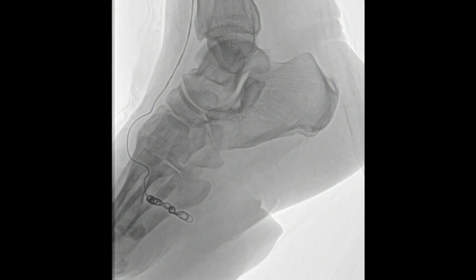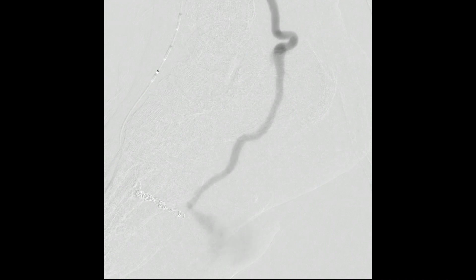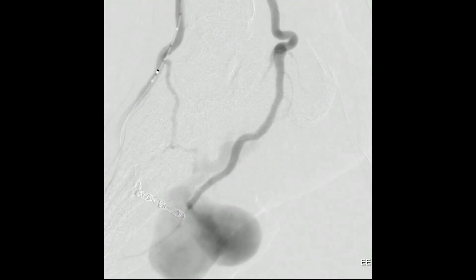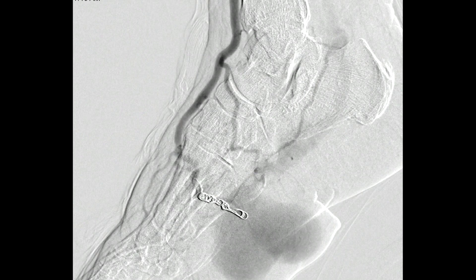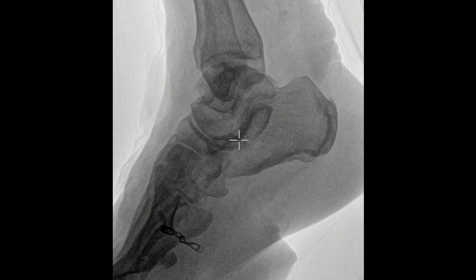After the initial coils there was still some flow going through this, so we went back and packed with 3mm and 4mm coils. You can see this coil was a little long. To get there we were using a directional microcatheter, through the left groin using the up-and-over technique to reach the right leg. The sheath was placed in the popliteal artery — a 7 French sheath — so we could inject even with the catheter in place. A mistake I made here is I should have backed it up with onyx right then.